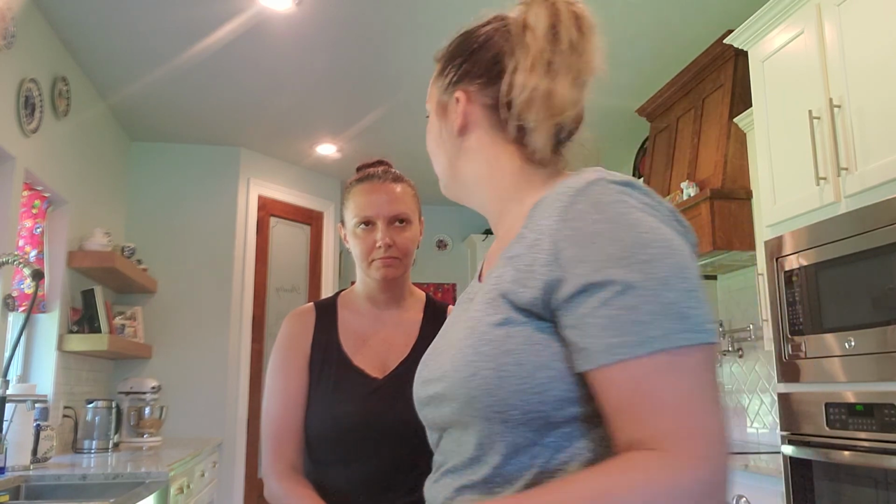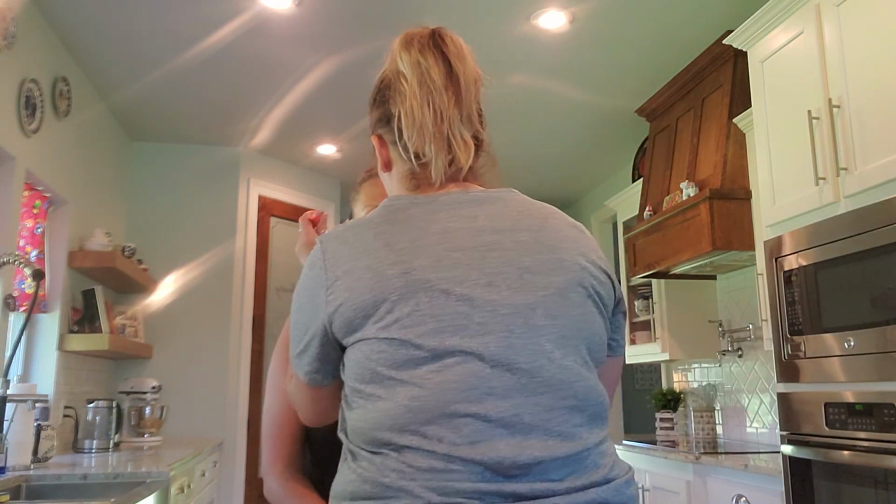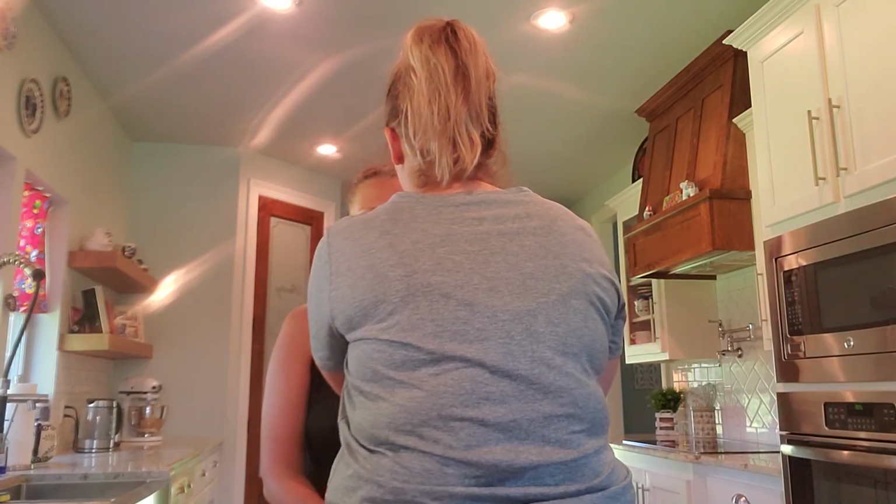They're good. I'm going to inspect the retinal background. My patient is going to remain in the same position. Search the retinal background, noting color and presence of lesions. Okay, the general background appears consistent in texture. The red-orange color of the background is lighter near the optic disc, and there are no lesions.